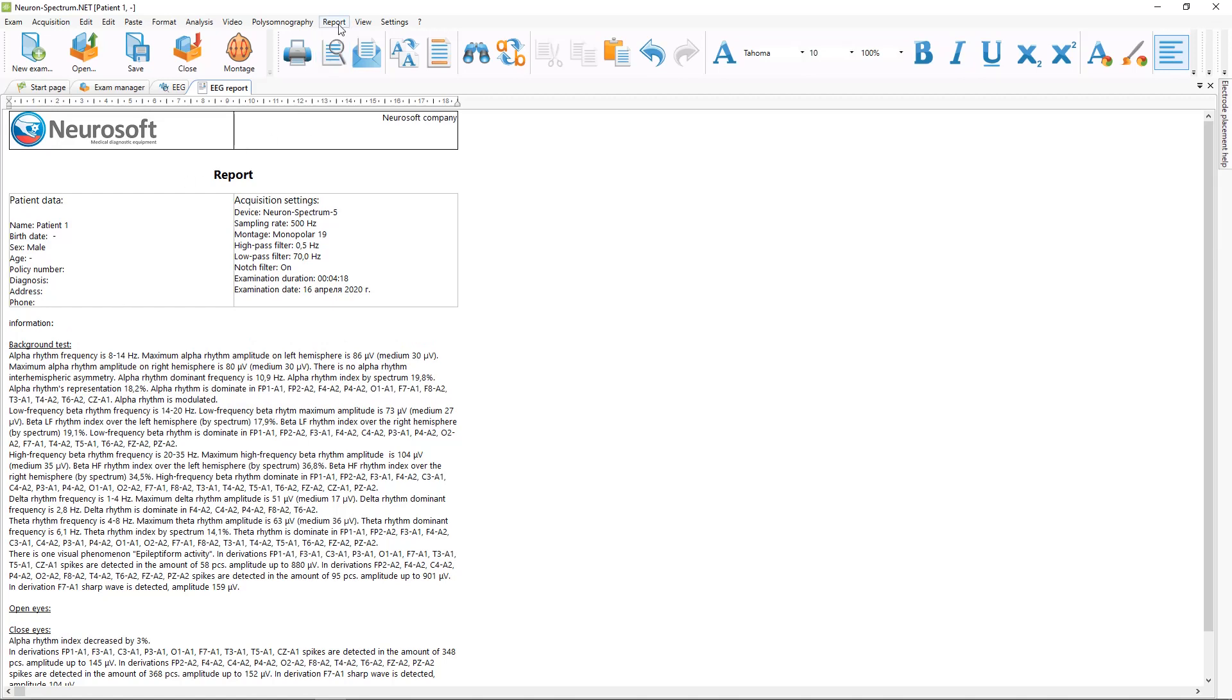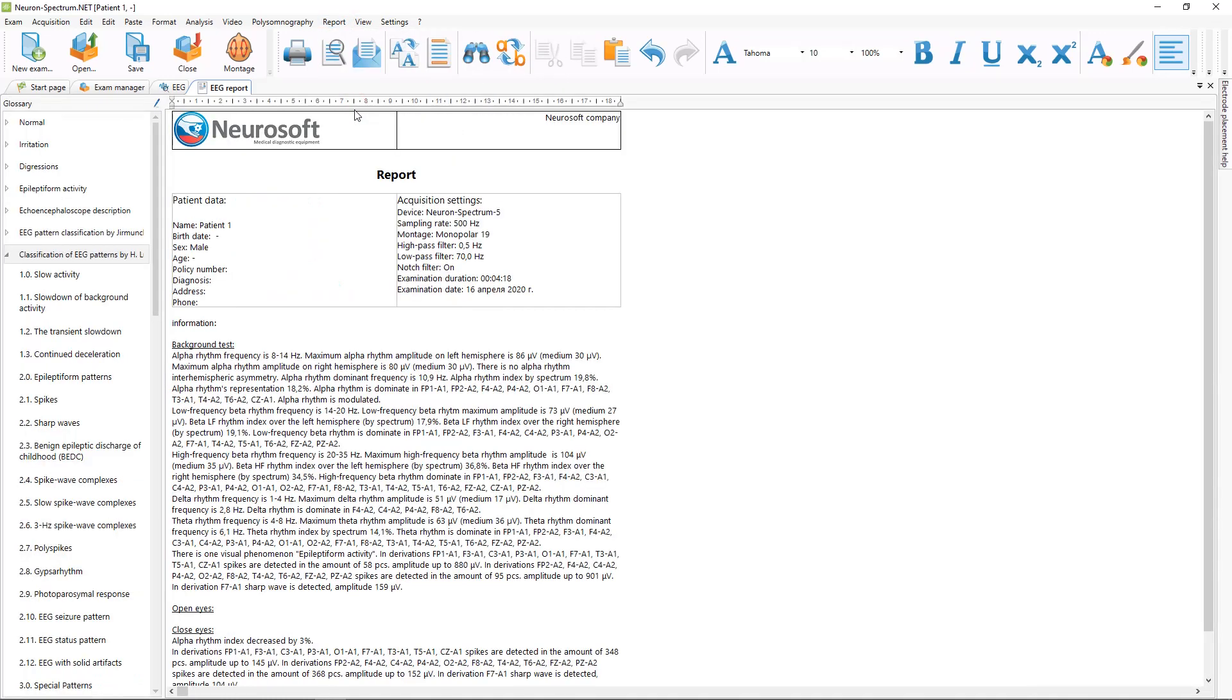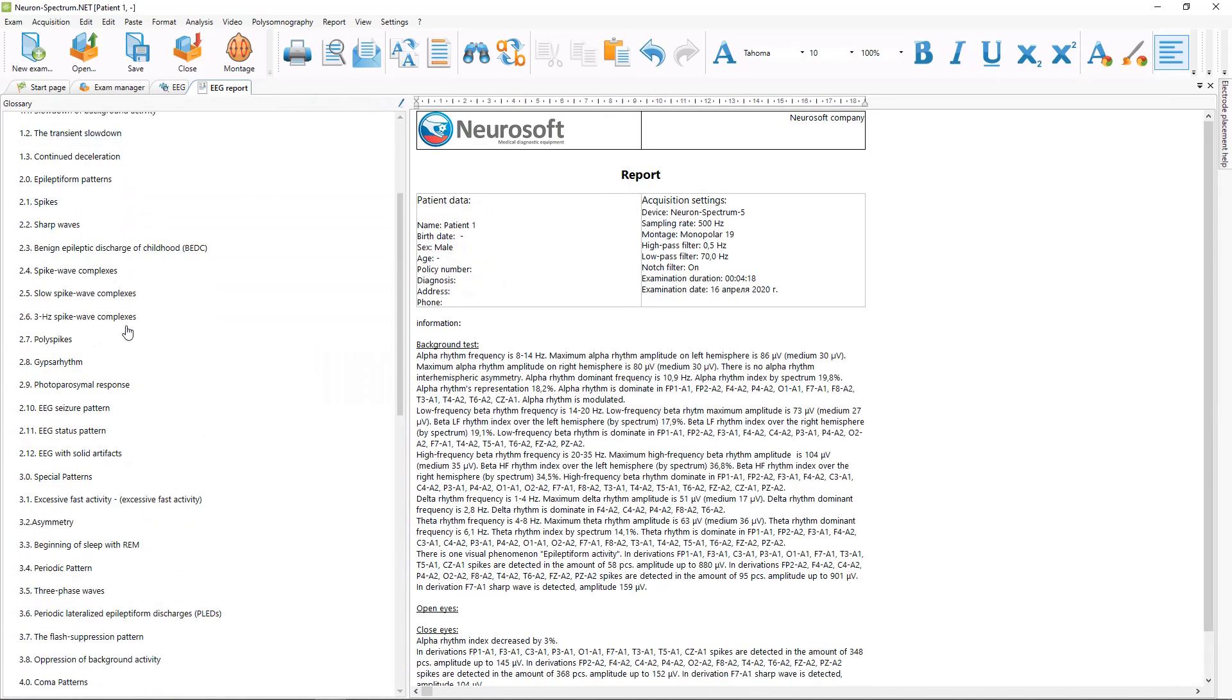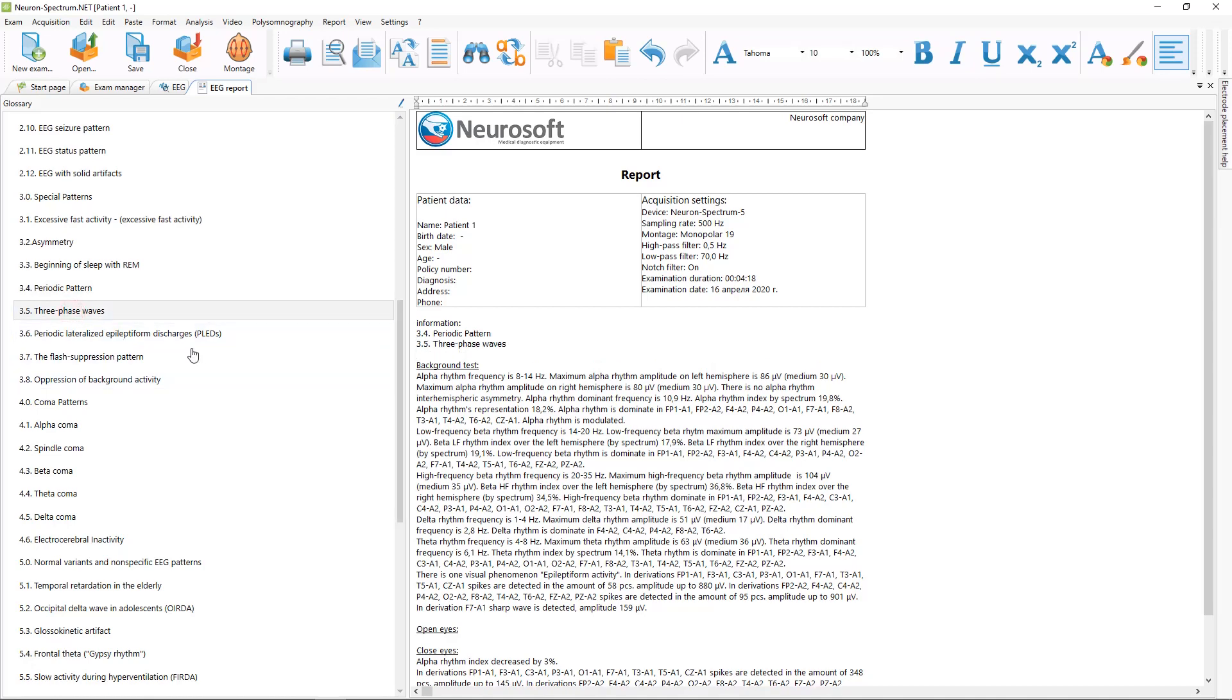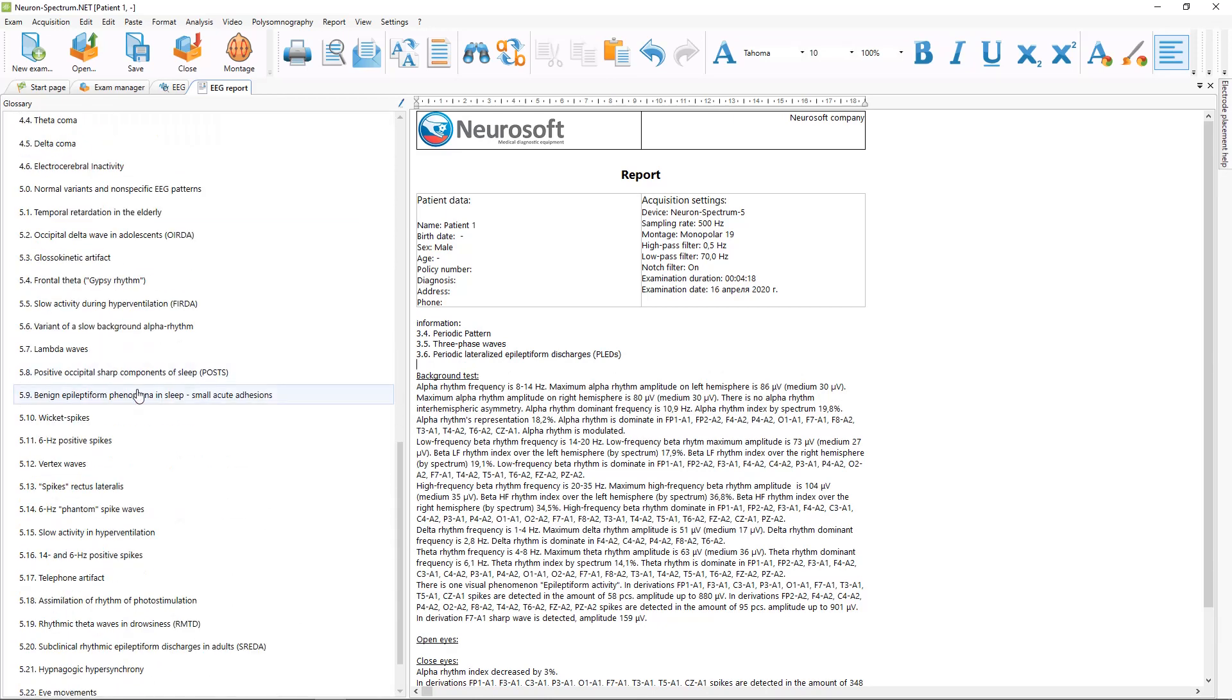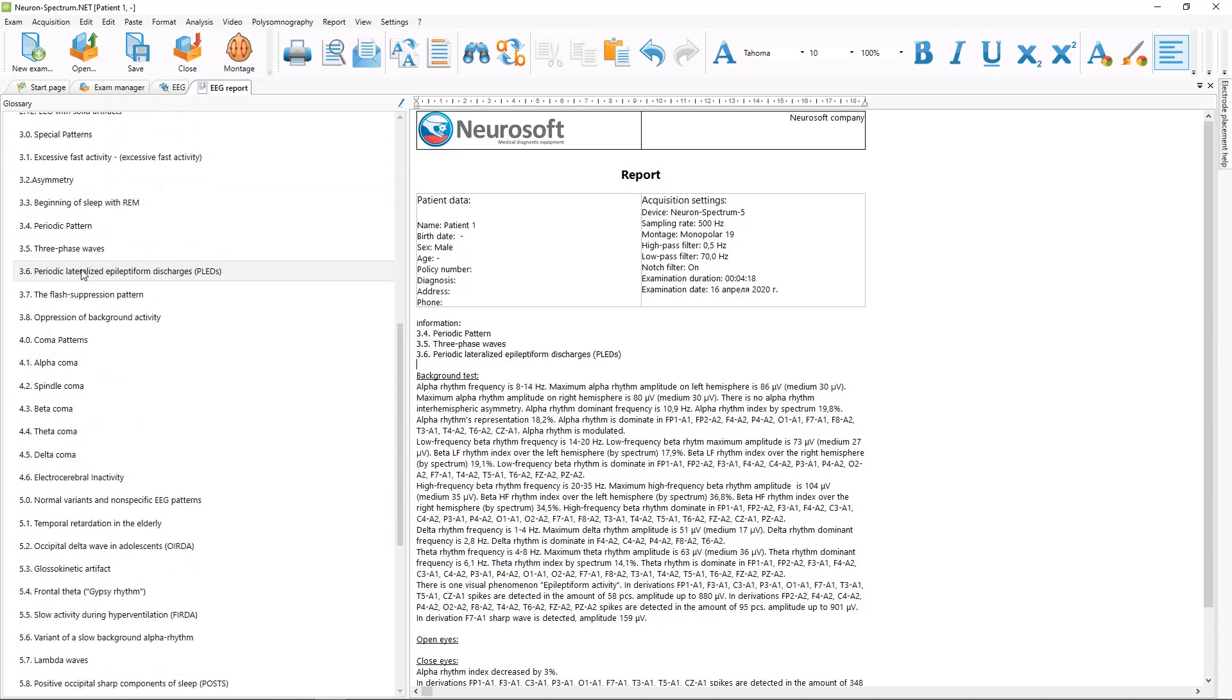Or you can use a special tool called glossary, which include commonly used phrases in the report. And using mouse button you can quickly include these phrases to your report like this. Also this window is editable and you can enter your own phrases to this glossary window to use them in your future reports.